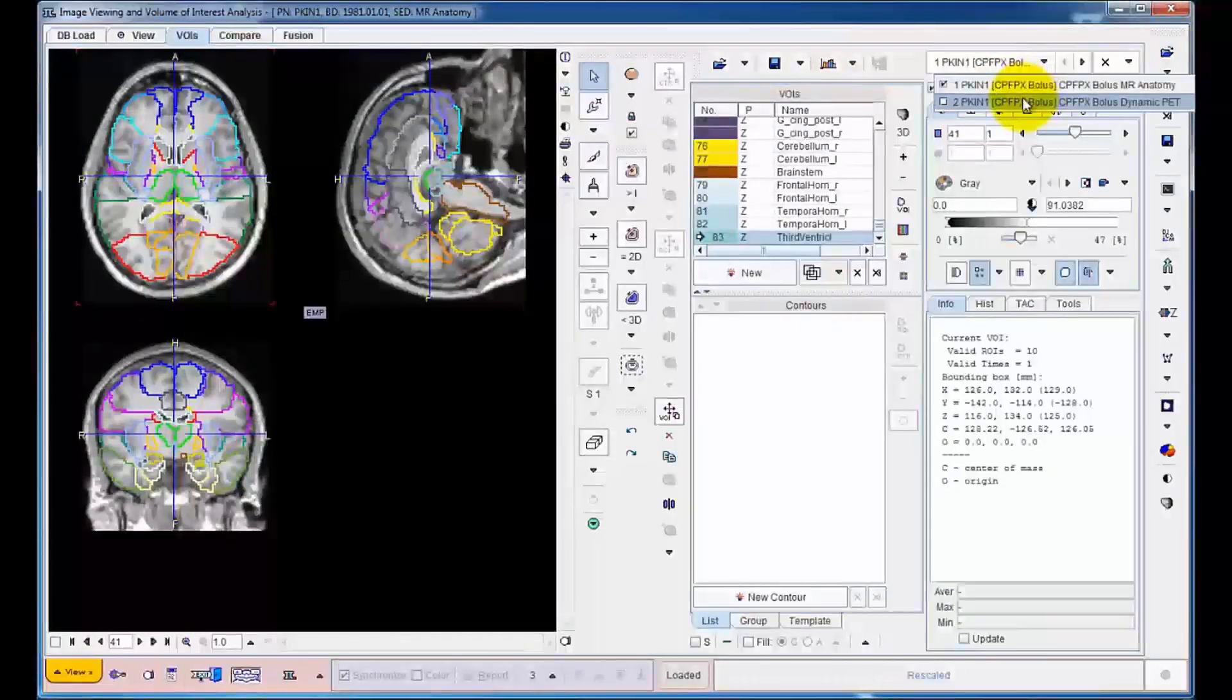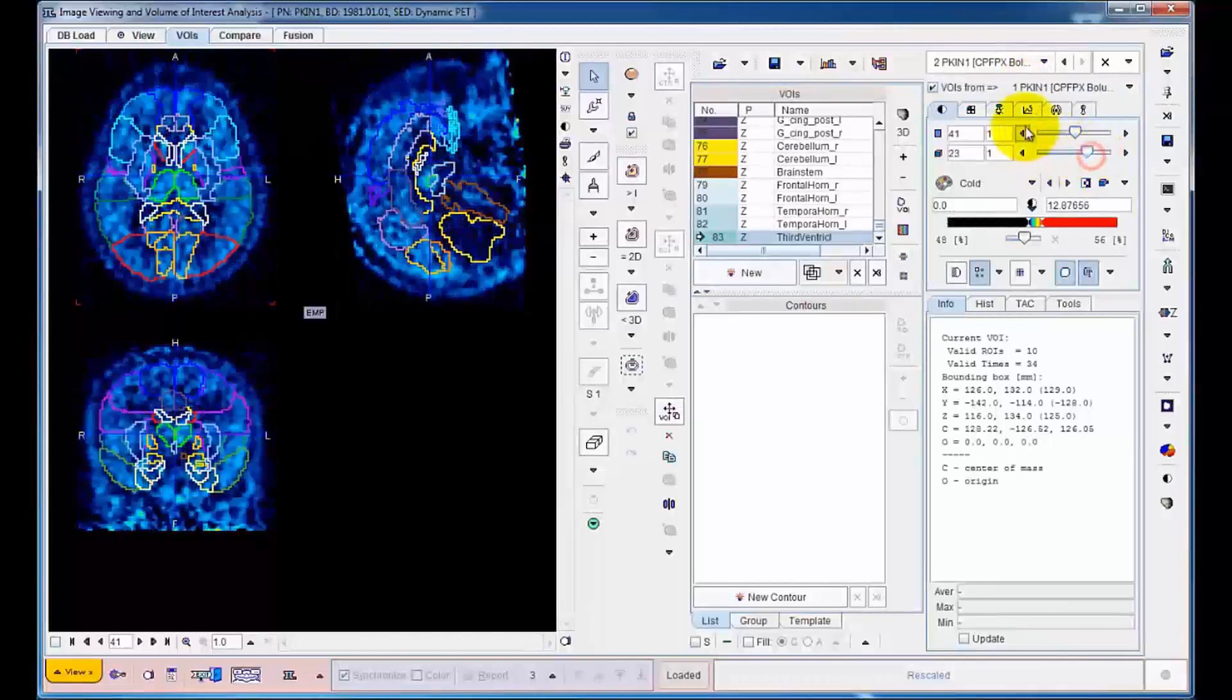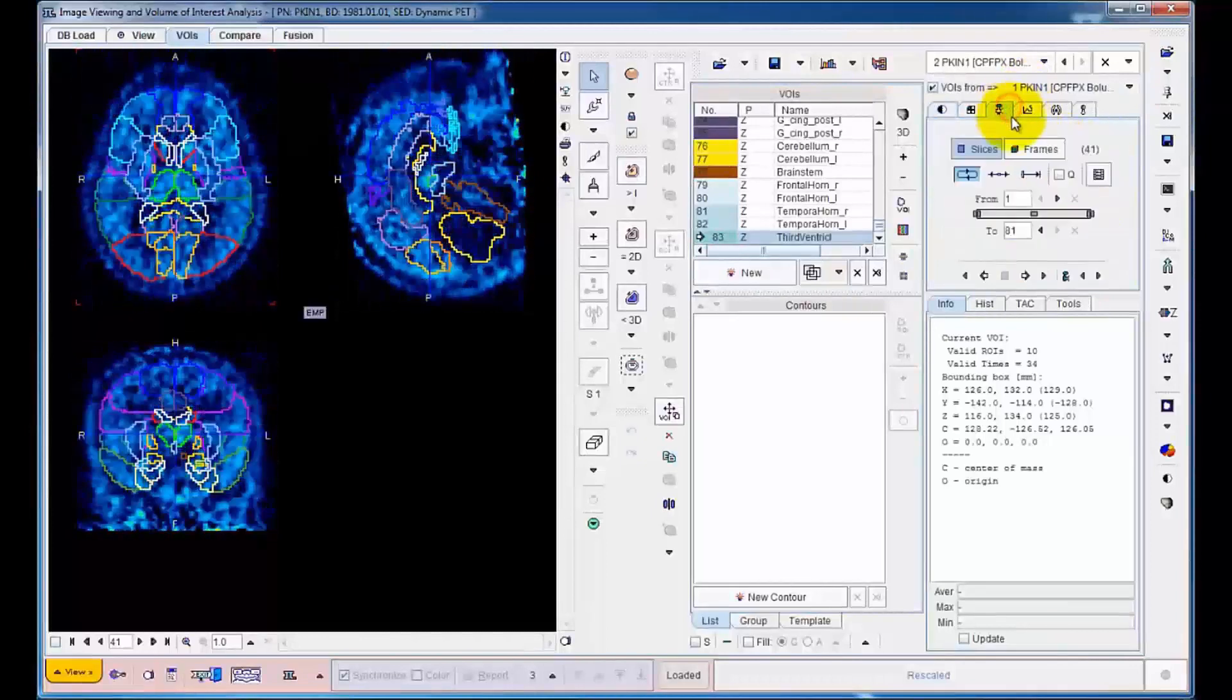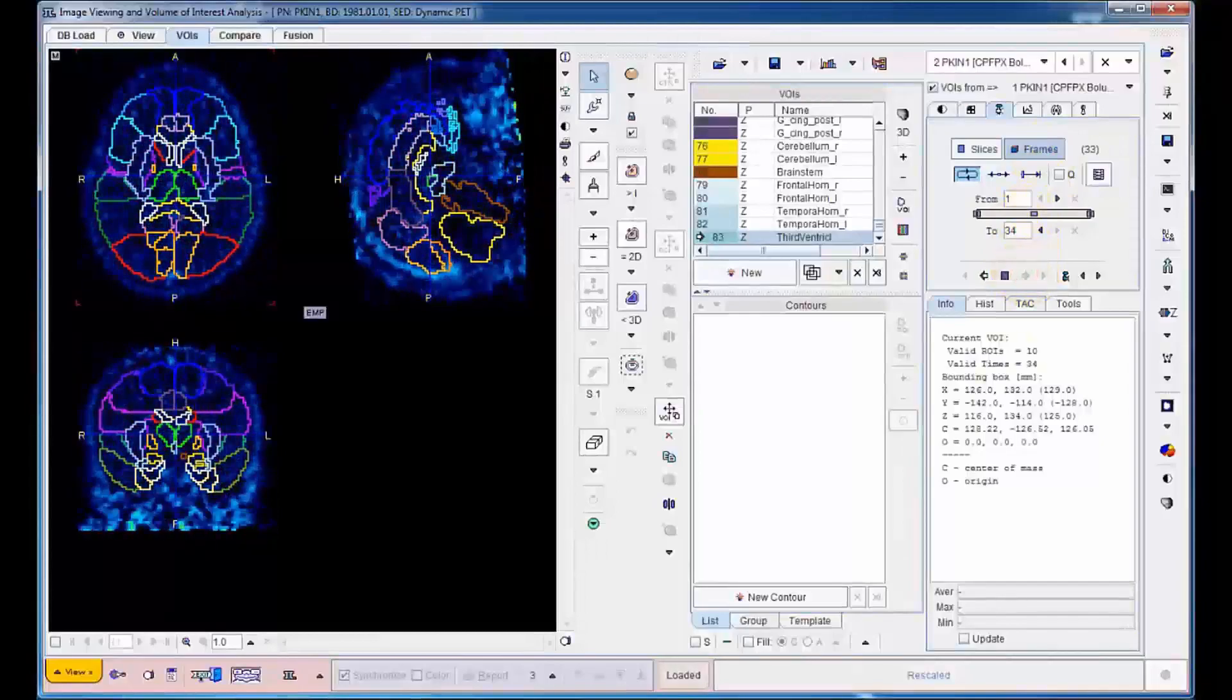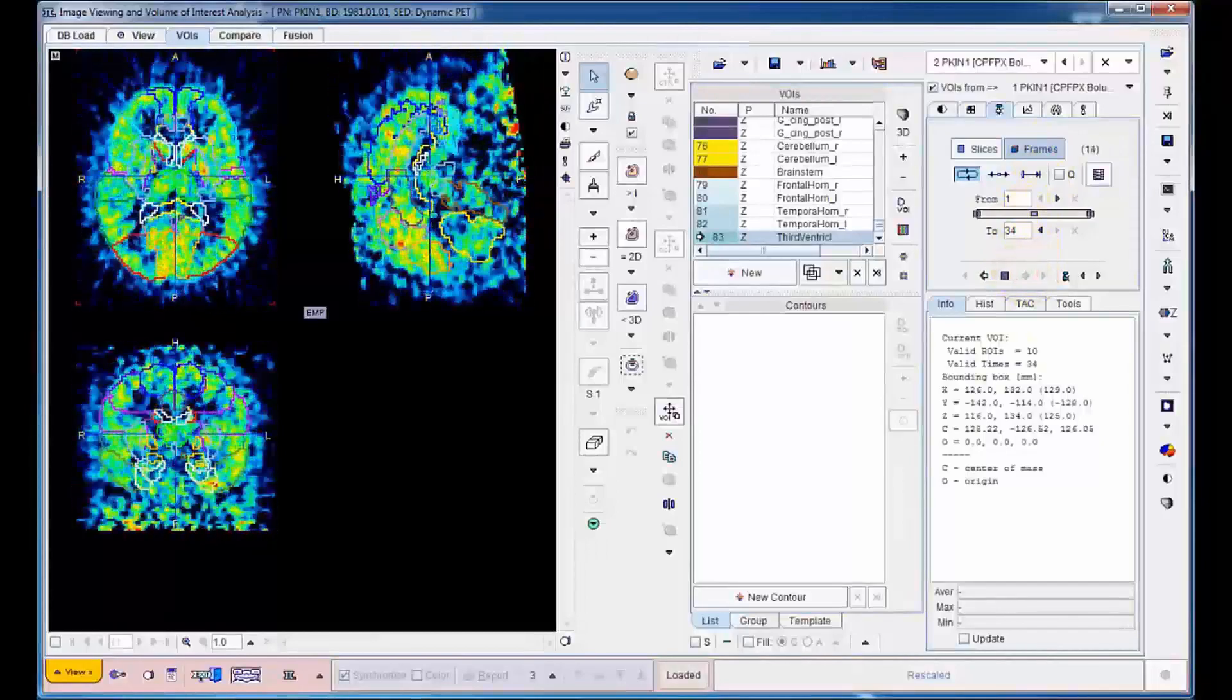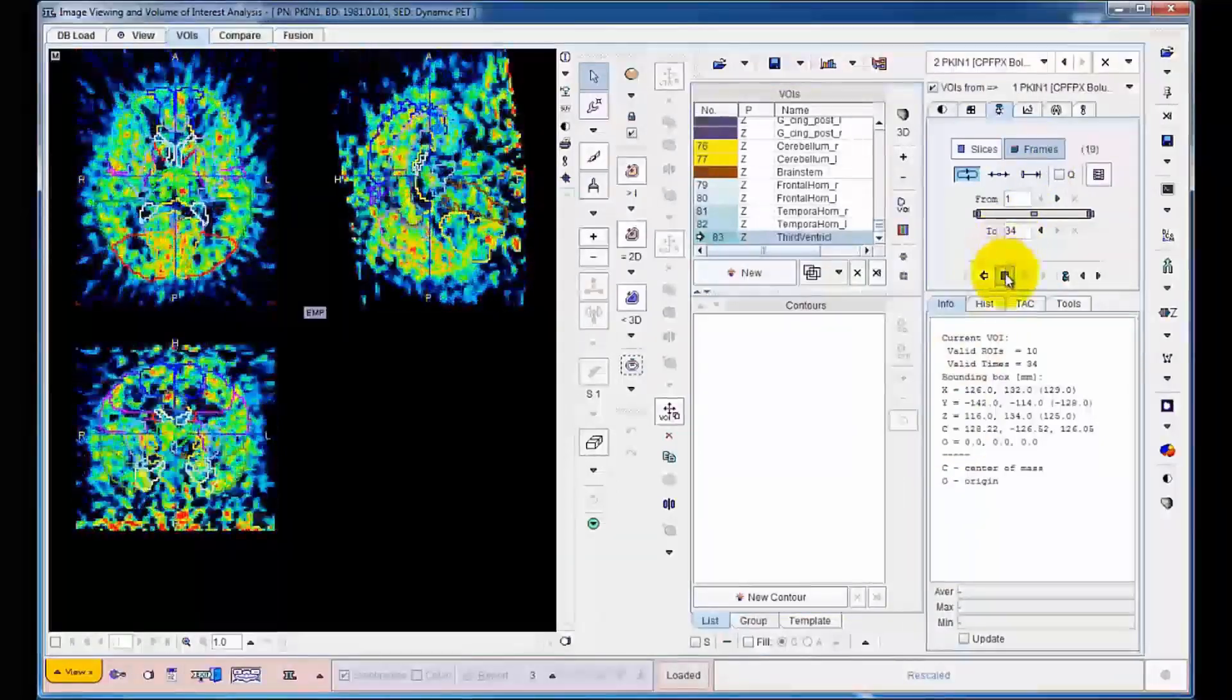Individual frames of the dynamic PET series can be inspected together with the VOI outlines, for instance, in a cinematic movie showing the uptake over time.